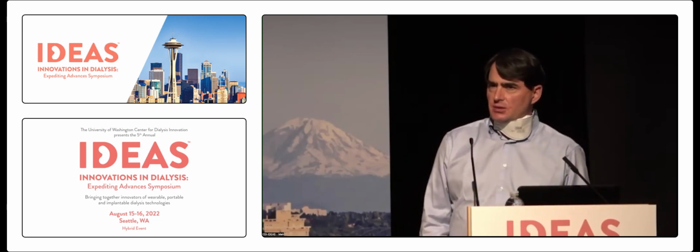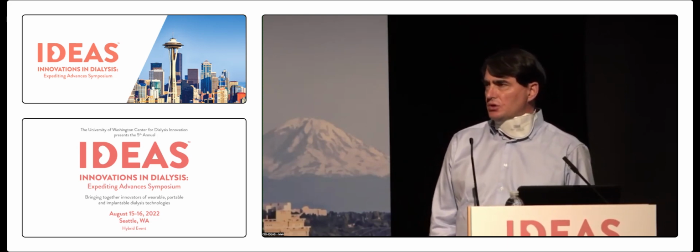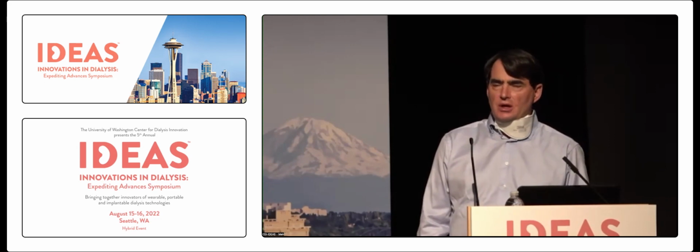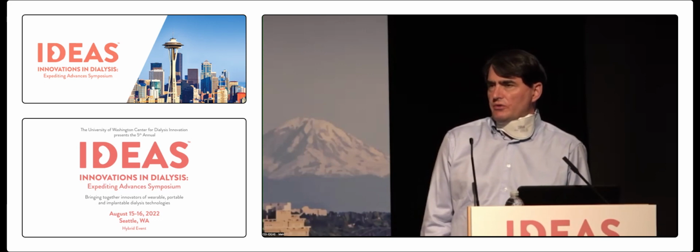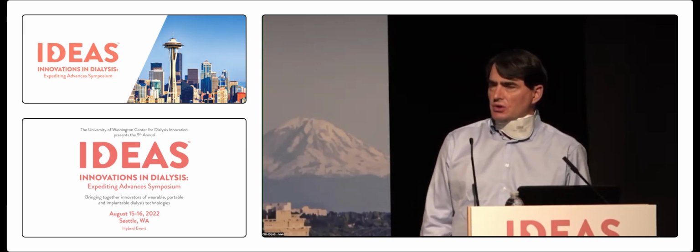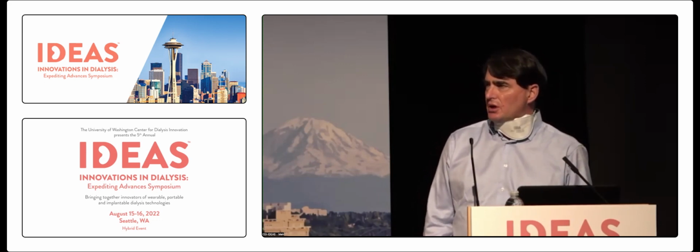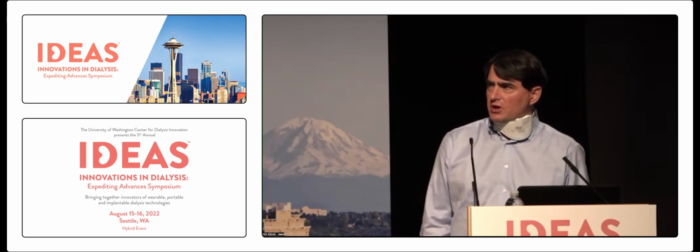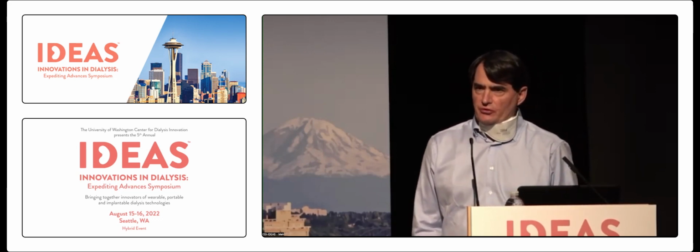We'd like to take the same approach because life is uncertain. Things are going to happen to an implantable artificial kidney. If you look at dialysis access as a paradigm, there are some patients who get one fistula once and they're good for 15 years. There are other patients who get fistula after fistula after fistula and end up with a catheter as their destination access. Everybody's different. I wouldn't presume to say today whether we will have a 15-year mean time between failures.